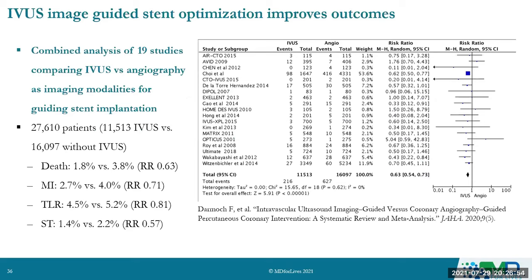Beyond that, we have some meta-analyses. So this is from 2020, looking at multiple different trials, most of which at the 1-year time horizon, and combining all of the data into one group. Again, meta-analyses are fraught with error and bias potentially, but it's better than at least a non-randomized trial. There was a reduction, for the first time demonstrated, in death.